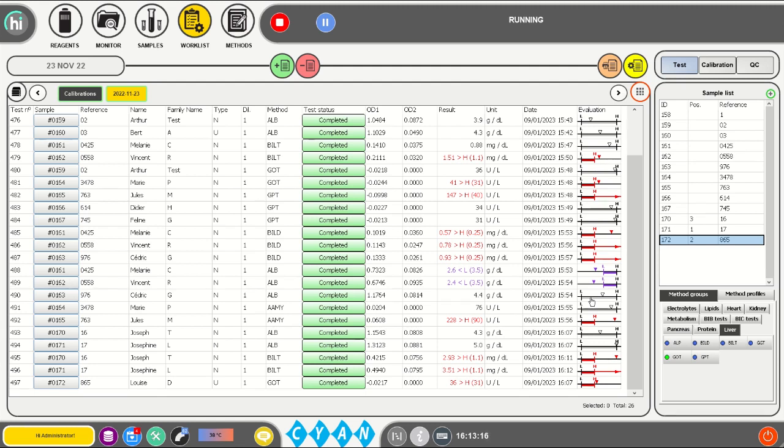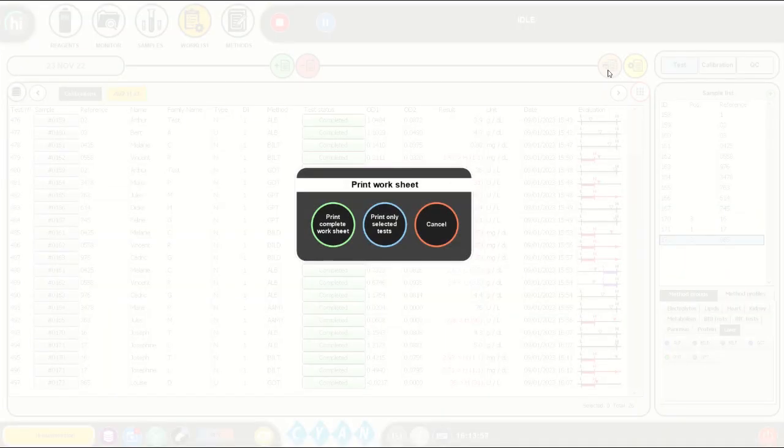If the measurements are performed with a valid reagent blank, calibration and quality controls, you can be assured of reliable clinical results. Depending on the requests of users, several types of reports can be created. To print the complete list of tests performed today, press the Print button. Choose if the complete work list or only a small number of selected tests will be printed.